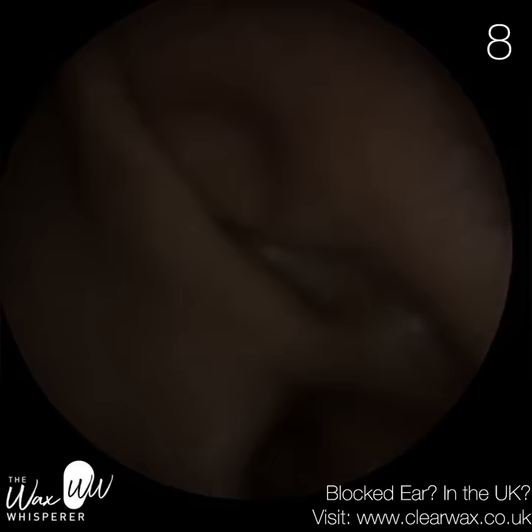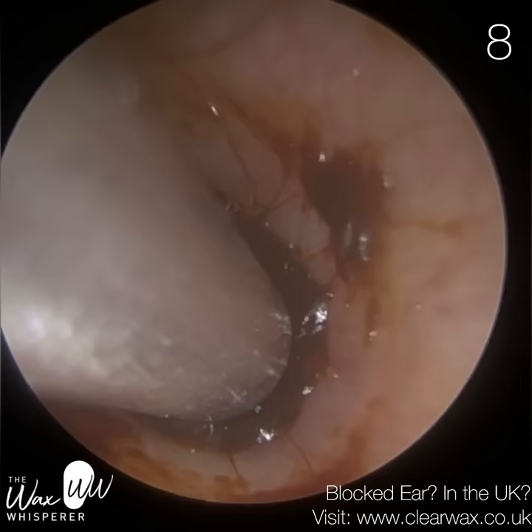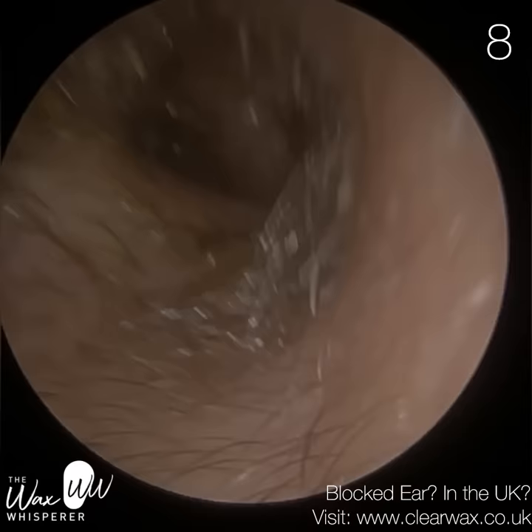Patient eight — this patient has clearly been poking inside their ears. They did well, actually, because this ear canal is so narrow and so bendy. You can actually see the indentation — I think they did cause some trauma. The wax is a bit red, so I expect there was some bleeding. Although there's no active bleeding now, the surface was a bit red, and I think the blood just stained the wax.